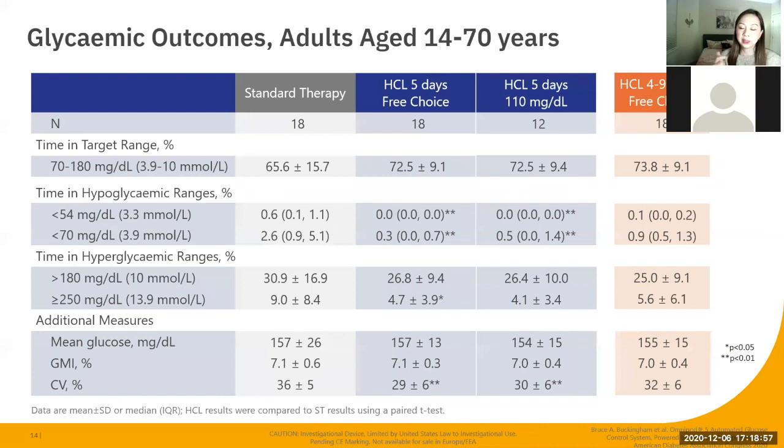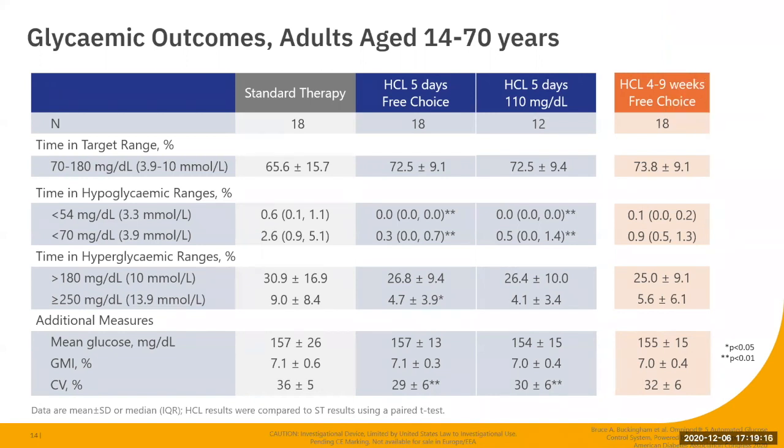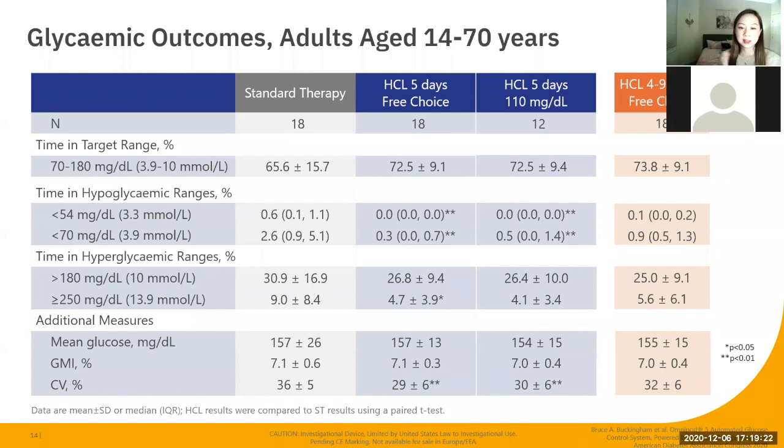So many of you may know that we had to pause our pivotal trial because of a software anomaly. This happened in about the March timeframe, and we took a few weeks to fix that software anomaly, and then everybody resumed the study in early June, and then we completed that study in September. So in June, we wanted to see, okay, we know that these 18 subjects continued their participation up until the pause. Let's pull that data and see what that shows.